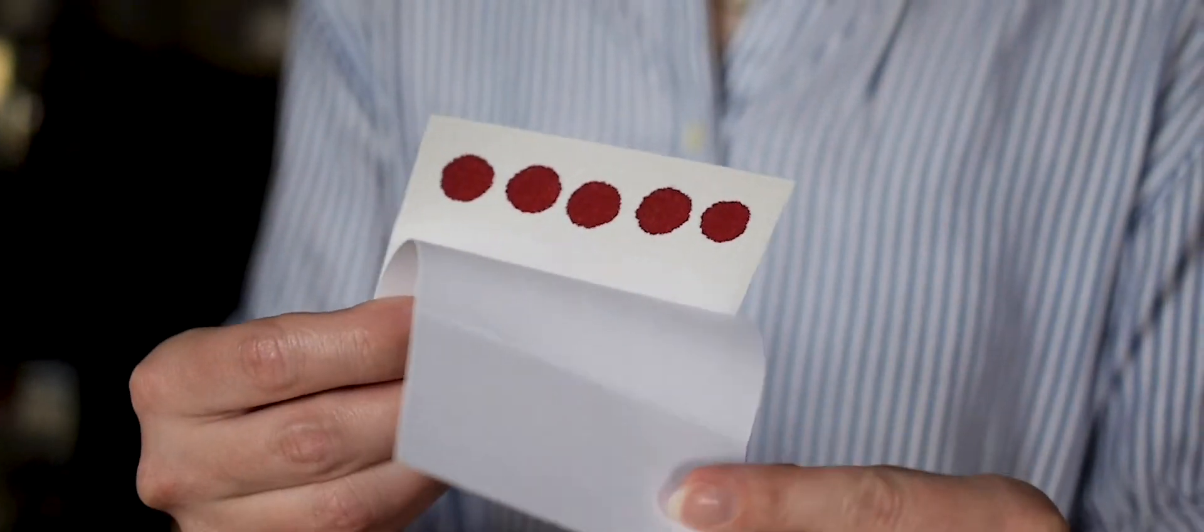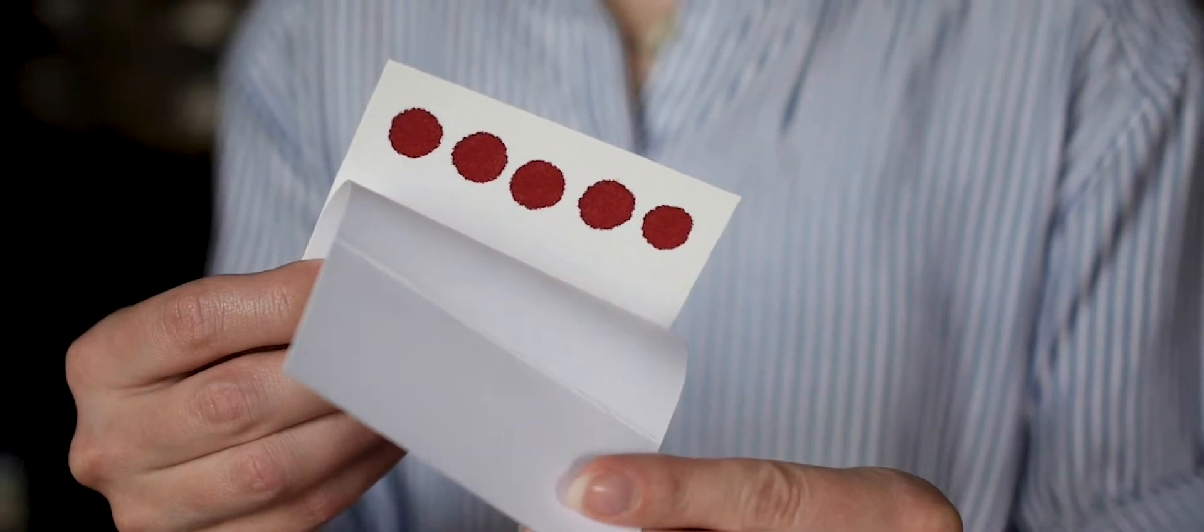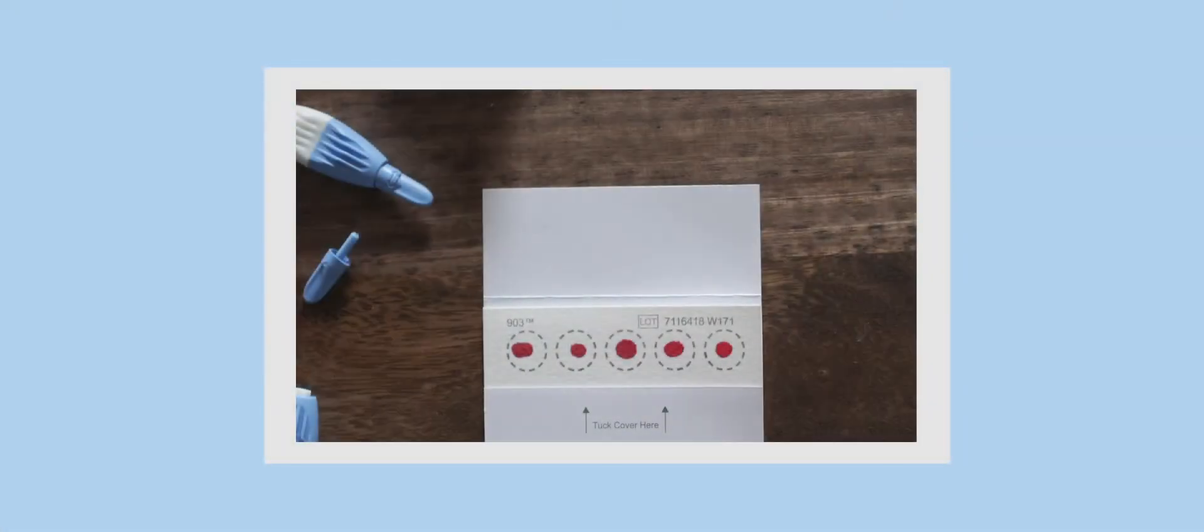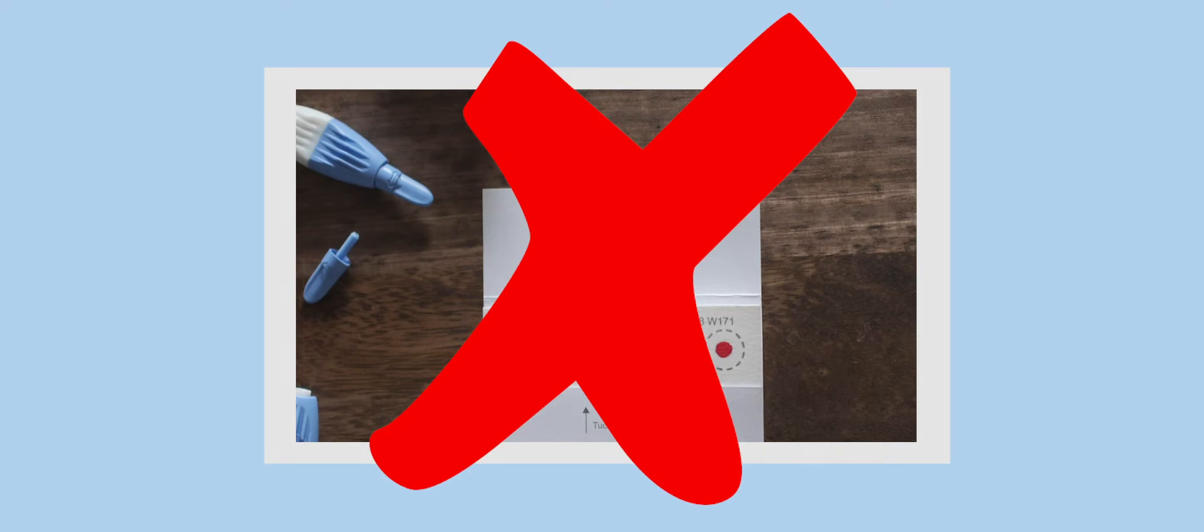It is okay if the blood drop falls outside the circles. Let the blood soak through the card to form full circles. It is important that you see the blood absorbed on the back of the card as well. Without full circles of blood absorbed through the card, the lab cannot use your sample.